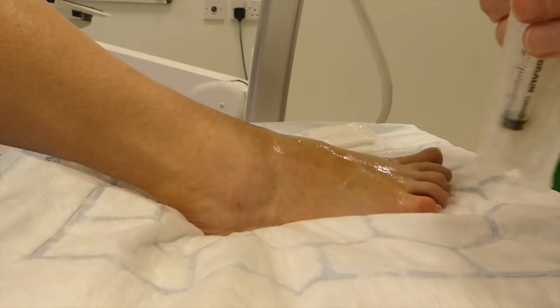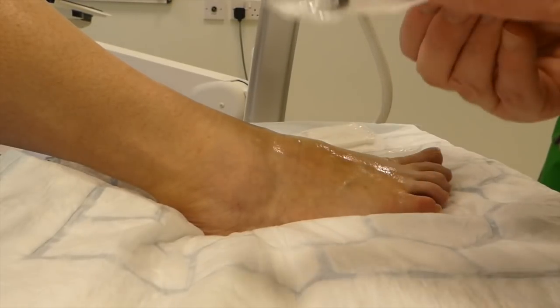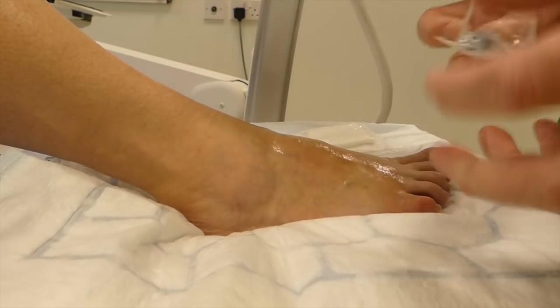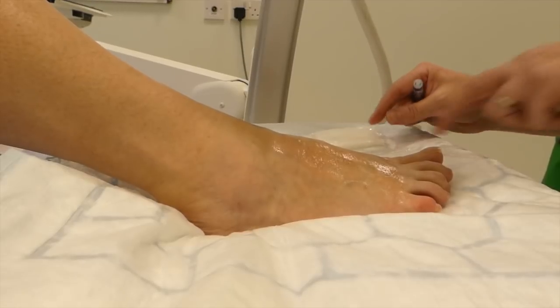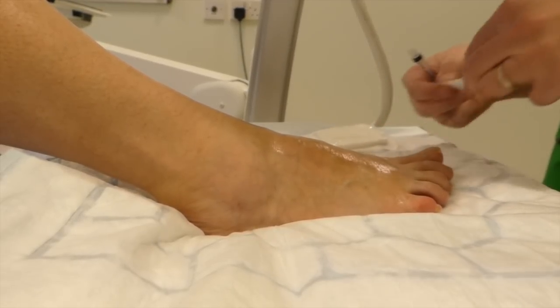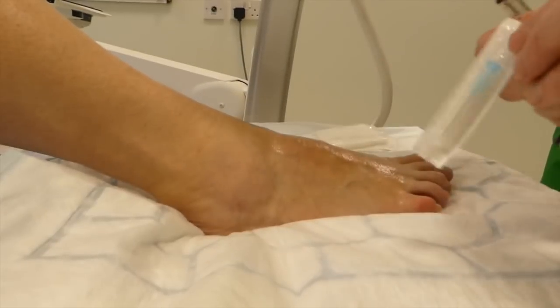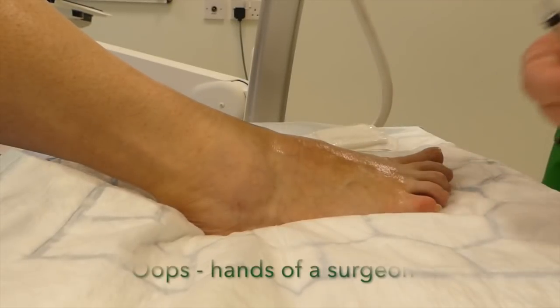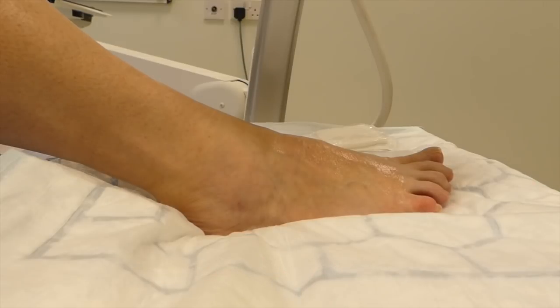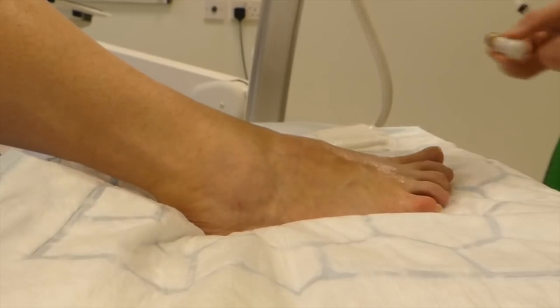It's a small joint so we're going to use a small syringe. For this one, a two-and-a-half mil syringe is about ideal. We're going to use a fairly wide bore needle to draw up with. We've got blues at the moment — ideally we'd have a green, but it's one of those days.